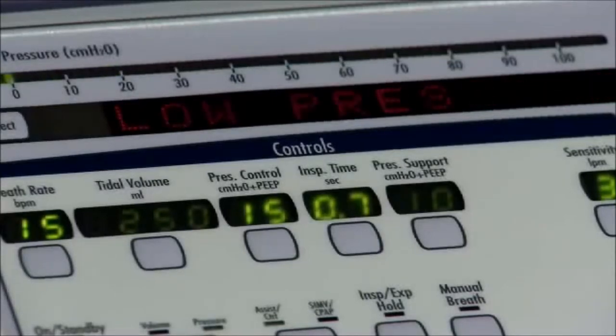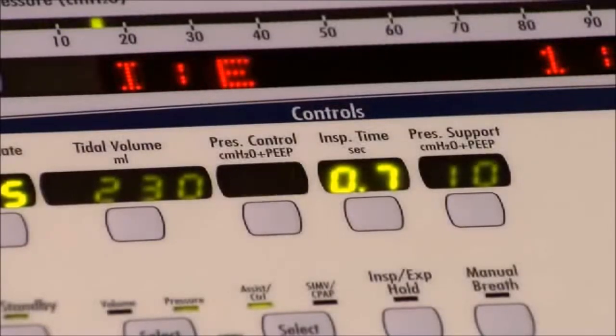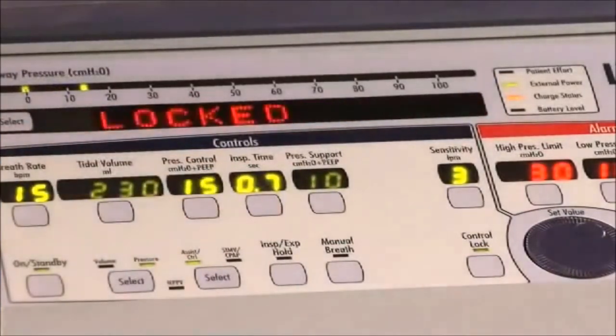The LTV control displays may flash or remain constantly visible. When a control flashes, it means one of the following: if you are changing a control setting and the display flashes, you have reached a limited value for the control — for example, you are trying to set a tidal volume larger than the inspiratory flow allows. If an alarm display flashes, it indicates that an alarm has occurred or is active. If a control display flashes other than when you are trying to make a change, it indicates a special condition, such as a flow terminated pressure control breath. If the control lock LED flashes, it indicates that someone tried to change the control settings while the front panel controls were locked.